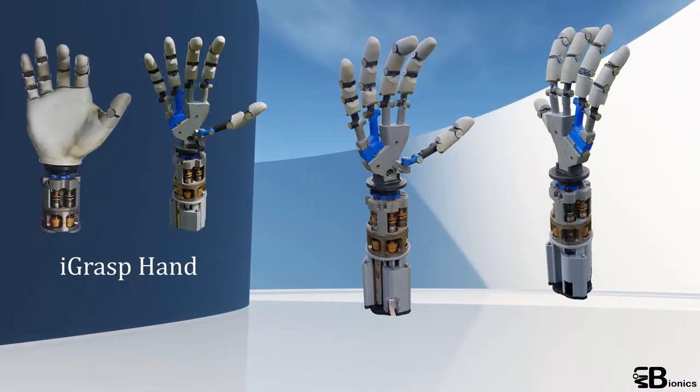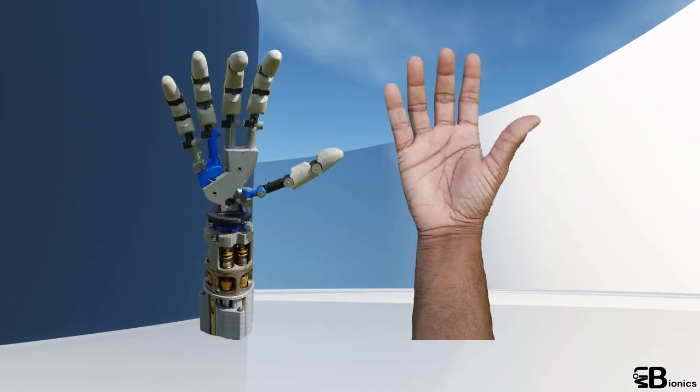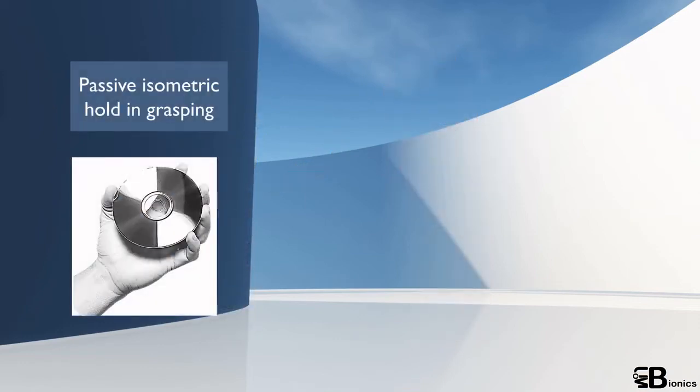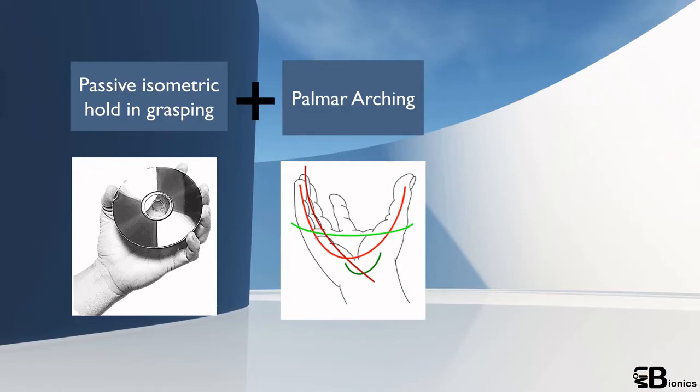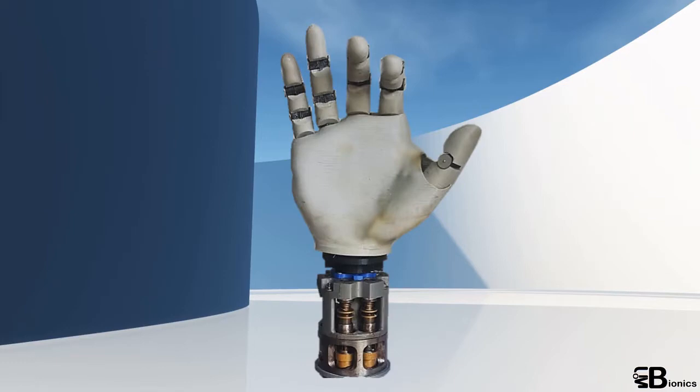Eyegrasp hand is a robotic prosthetic hand developed for people with transradial amputations, which means amputations below the elbow. This prosthetic hand is developed with features such as passive isometric hold, palm arching and thumb opposition, while maintaining a close resemblance to the human skin using flexible surface materials.